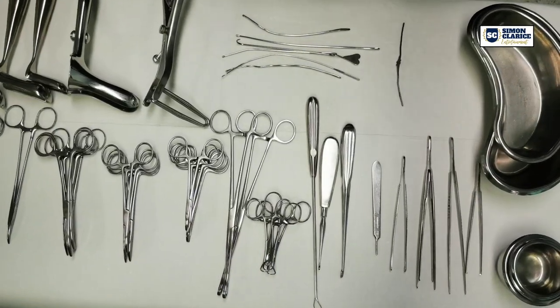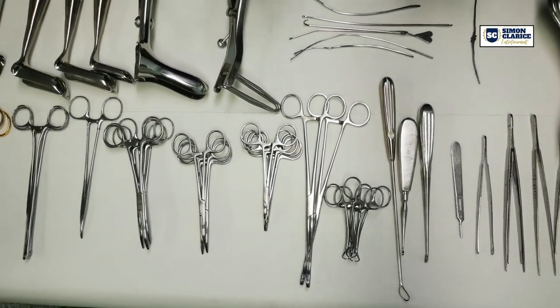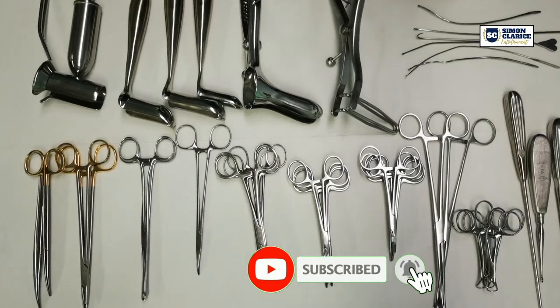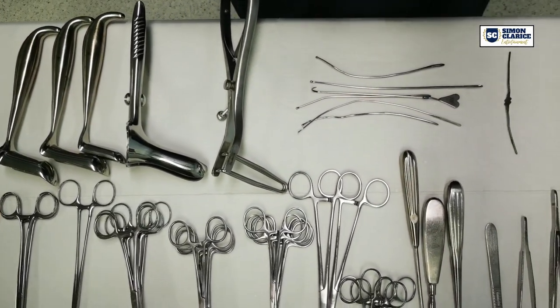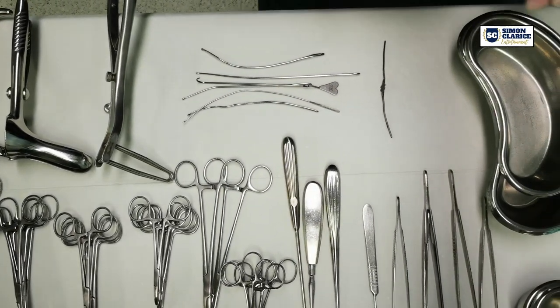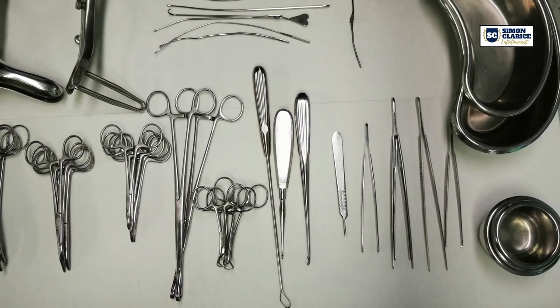Hi everyone, this is our 54-piece anal set. This set in particular is mostly preferred by our surgeons when they do anal surgeries. Let me first start by telling you what's inside the set. The 54 pieces consist of the following.